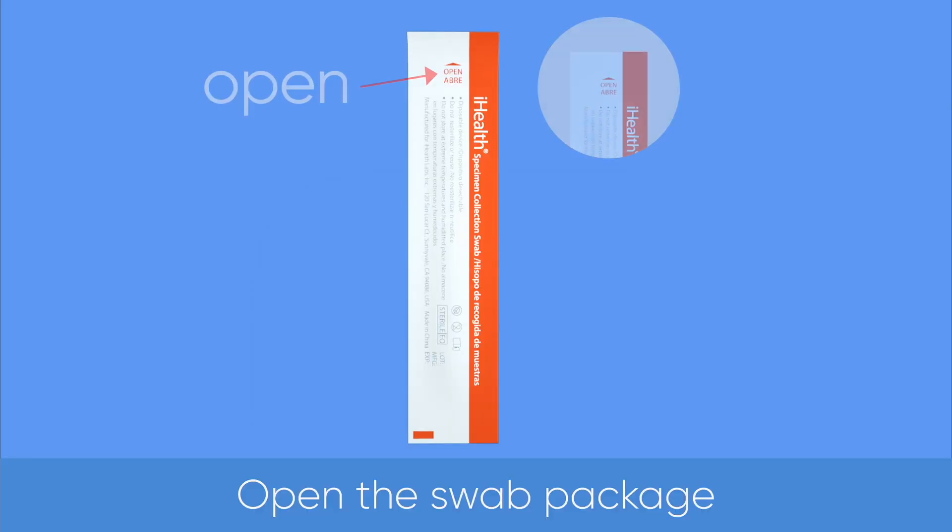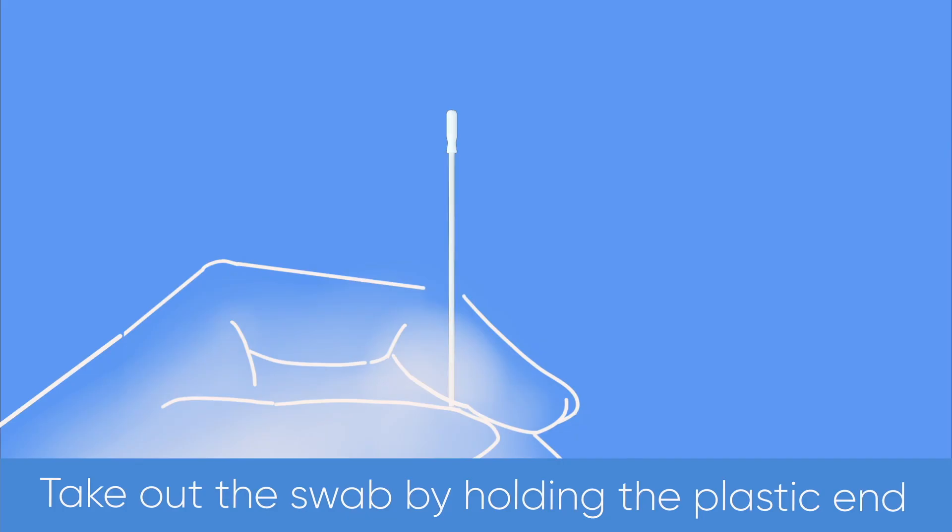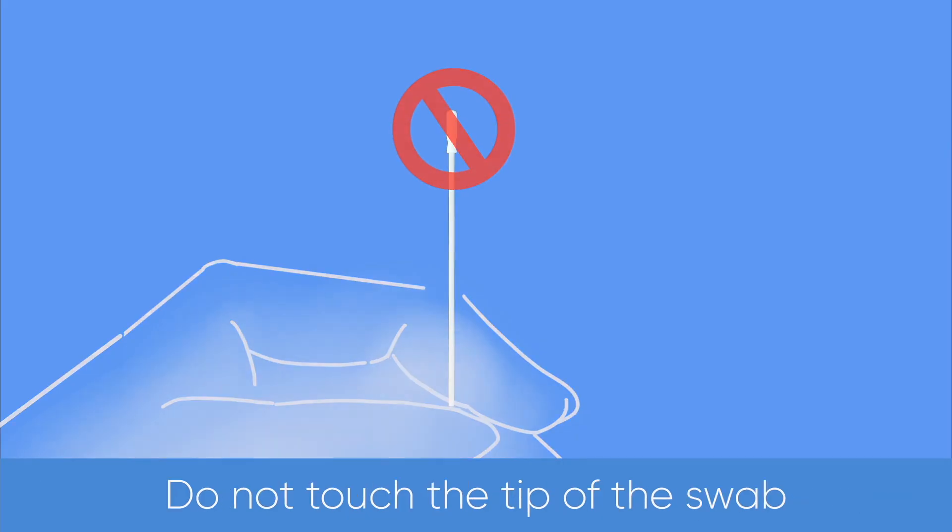Open the swab package. Take out the swab by holding the plastic end. Do not touch the tip of the swab.